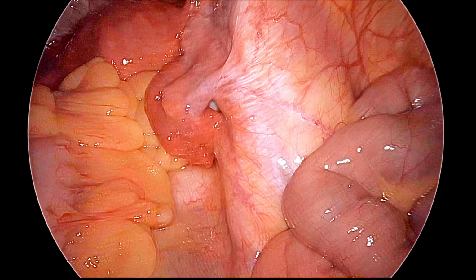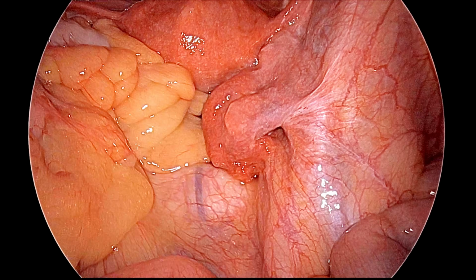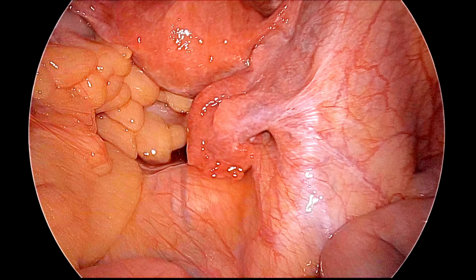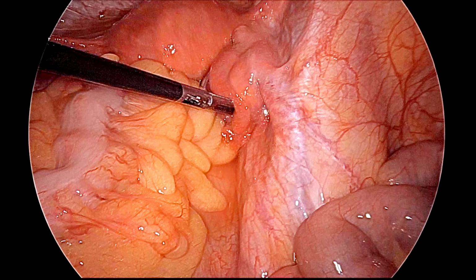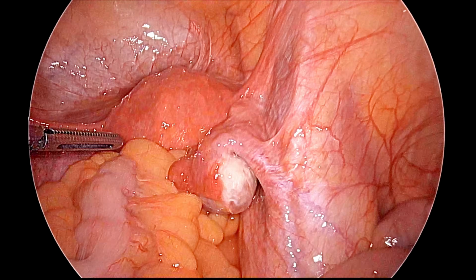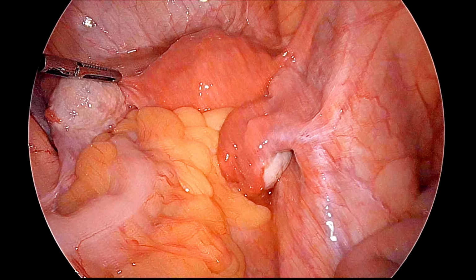Here is the Cooper ligament, and this area lies between the two medial umbilical ligaments, the bladder. This is the sacral promontory, and in the middle of the sacral promontory you can see the median sacral vessel, the blue one. Once you put the sigmoid colon towards the left side, you can see this is the IP ligament, and this is the ovary. To get the ovary, you lift the ovary and tube with the IP ligament. This is the left side ovary and tube.